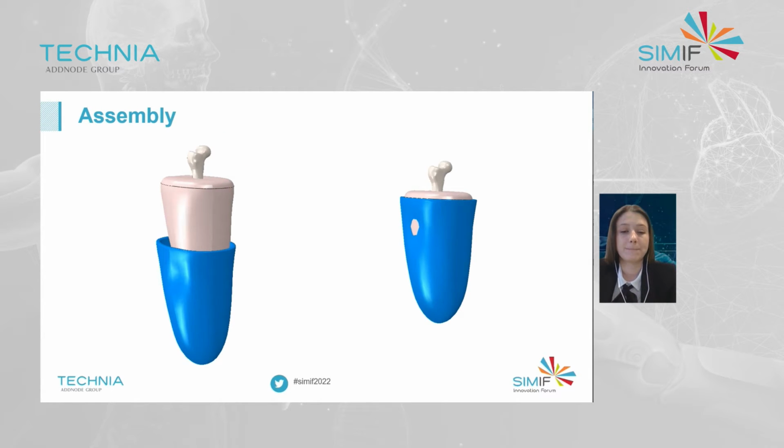So it is possible to identify the initial overclosure between the soft tissue and the socket, which will be solved during the numerical simulation of the socket donning procedure. The socket was designed with the press fit. It means that there is a cross-sectional area reduction.